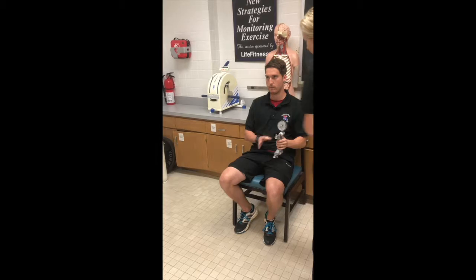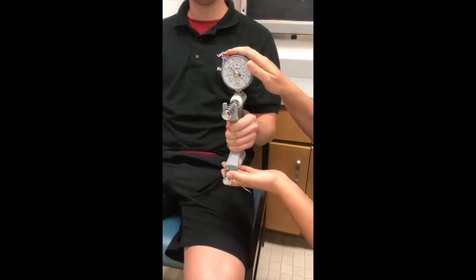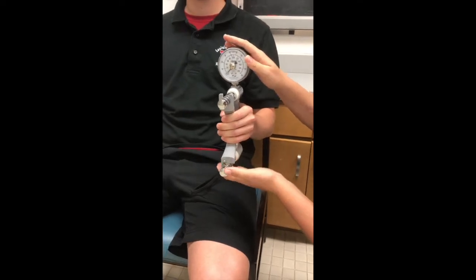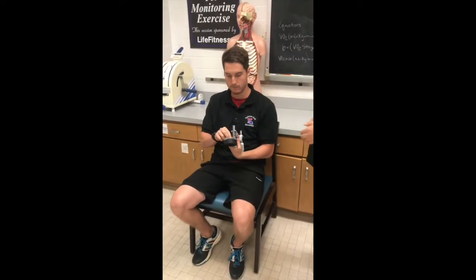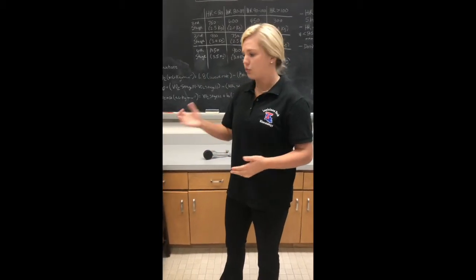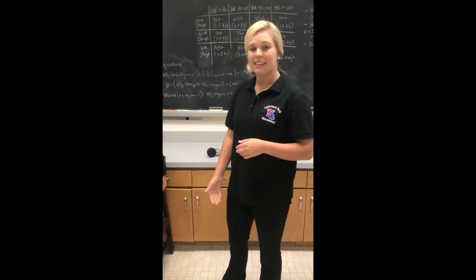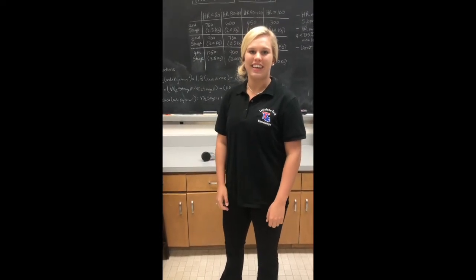He'll switch to his left side. I'll come in and hold it steady. I'll say, 'Are you ready?' and cue — 'Harder, harder, relax.' We'll record this score. Each arm is given 30 seconds to a minute of rest when switching. He'll record his maximal score, and that is how you perform the protocol for grip strength testing.